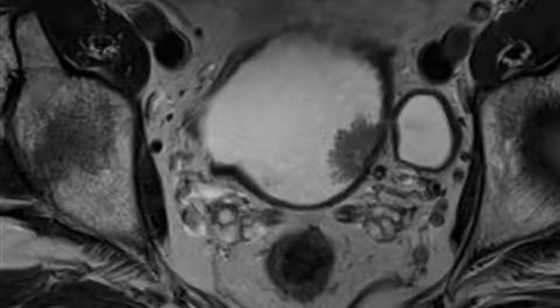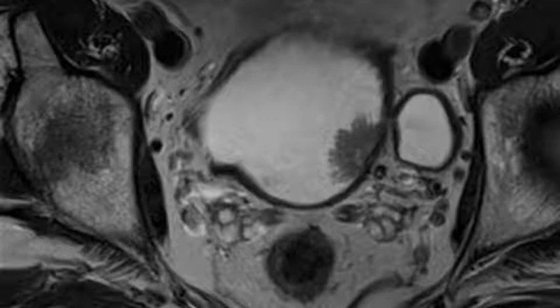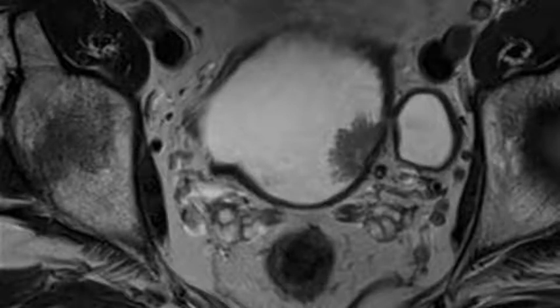The homogeneous opacification of urine has been claimed to improve bladder cancer detection, particularly on the non-dependent surface of the bladder. Specialist techniques have been suggested, such as having patients void prior to CT and then administering intravenous diuretics to increase bladder filling. It is possible to visualize bladder wall enhancement and thickness on nephrographic phase CT scans.